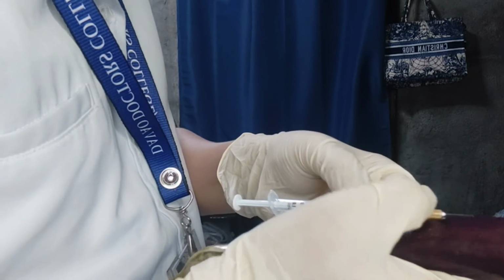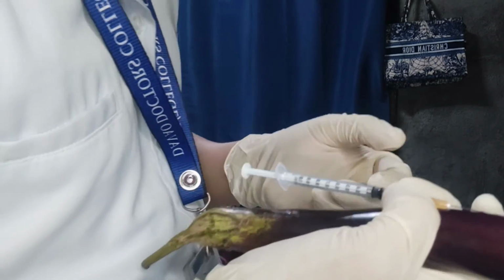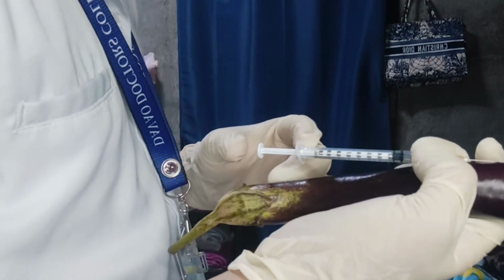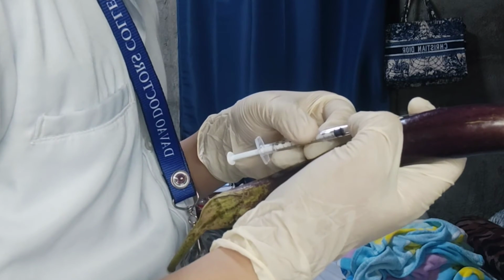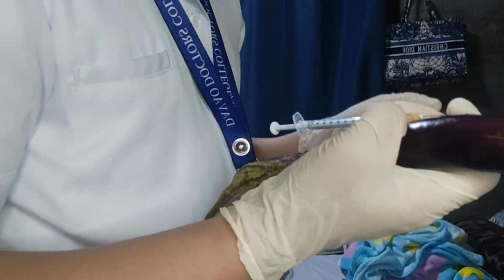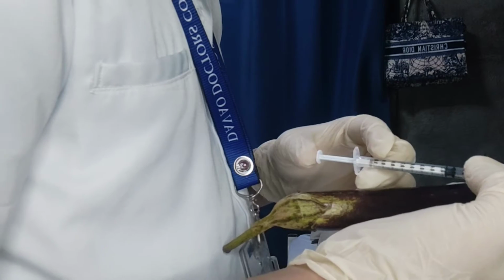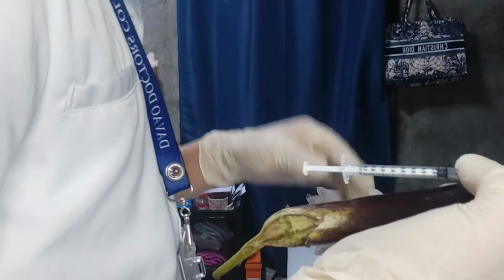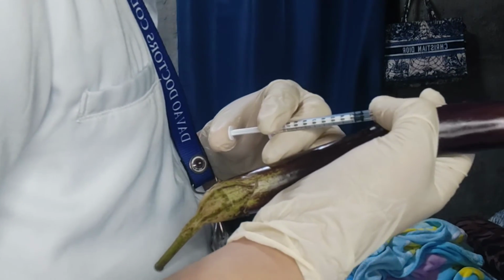Next we're going to stabilize the syringe and the needle. Inject the medication carefully and slowly so that it produces a small wheal on the skin. Then we withdraw the needle quickly at the same angle in which it was inserted. Activate the needle safety device. Apply a bandage if indicated. So we're going to withdraw.